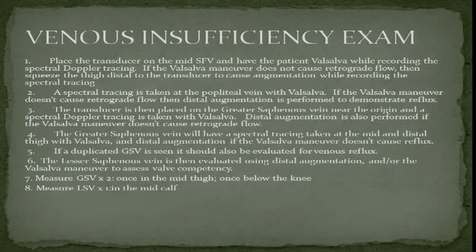Correct? If coughing is producing the reflux, that's good, right? But you don't do coughing, then this, then that. No, you have produced the reflux, you've got your answer.